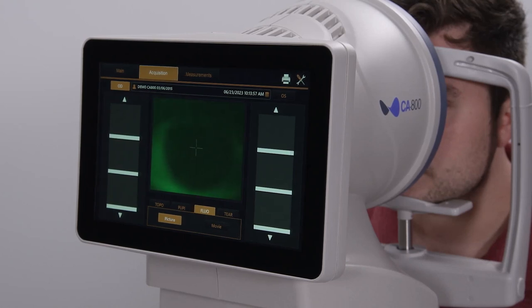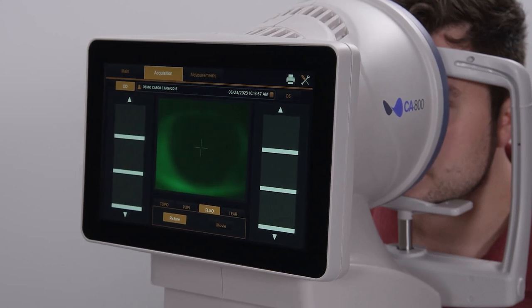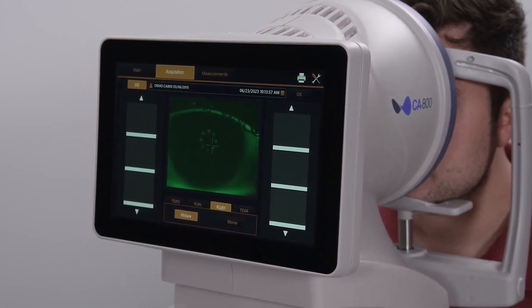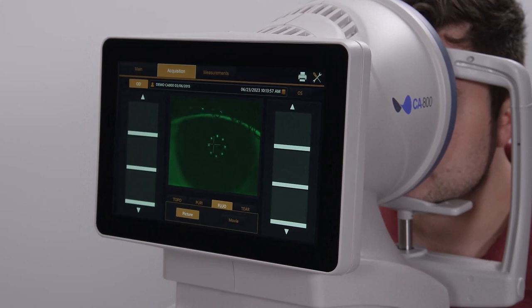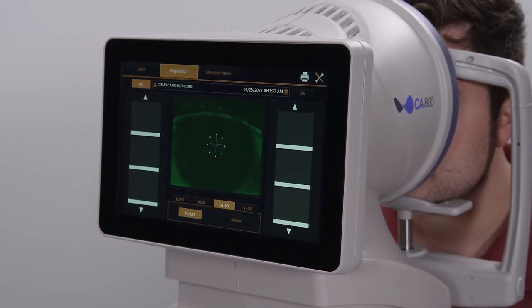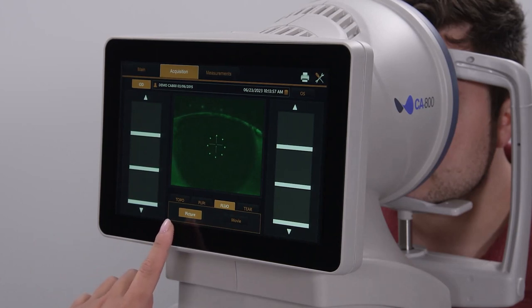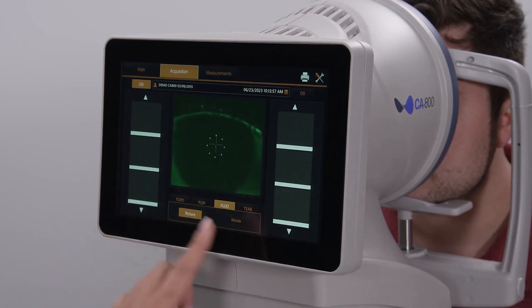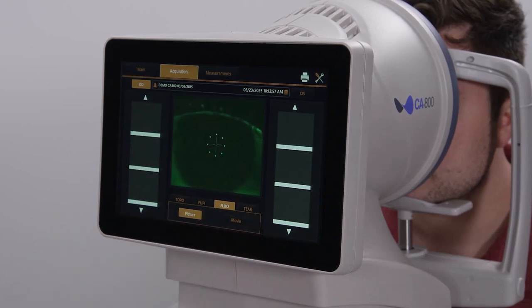Position the patient and instruct them to look at the target in the center. Use the joystick to move the CA800 towards the patient until the eye is clearly in focus. If you would like to take a picture, click on picture. If you would like to take a movie, click on movie. Press the joystick button to capture the image or to begin capturing the video.